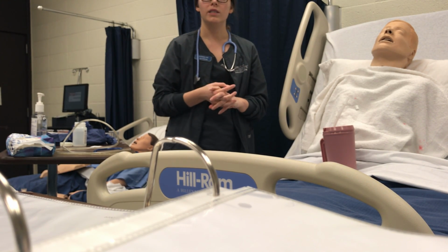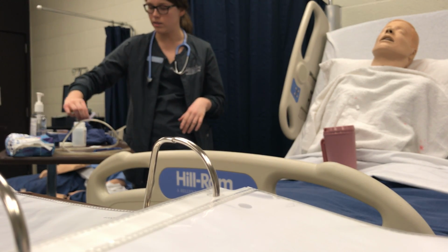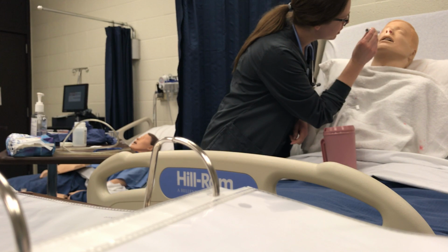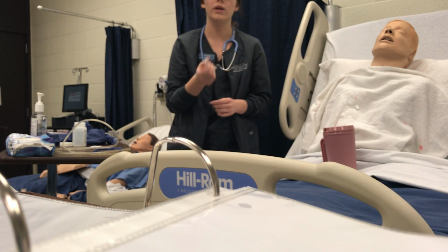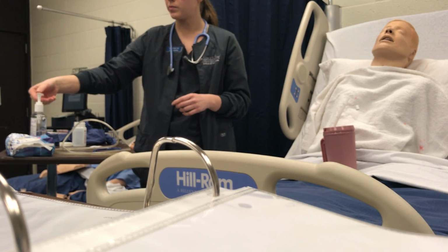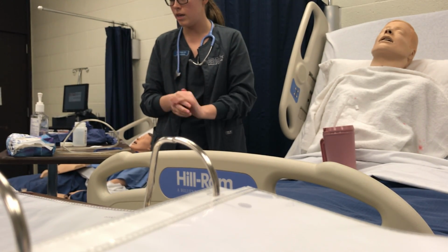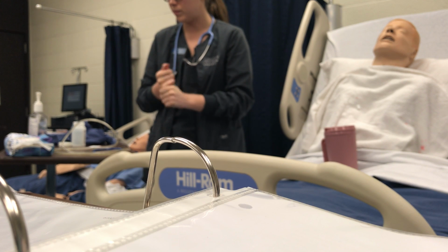All right, so once I had established that with my patient, I would want to assess the nares, just to see which one was going to provide the most airflow, which one was going to be the most patent. I think the right one is, and that's on my dominant side, so we're going to go ahead and go with that. So once I had done that, I'm going to do hand hygiene, and then I'm going to place my gloves on to measure the tube here.